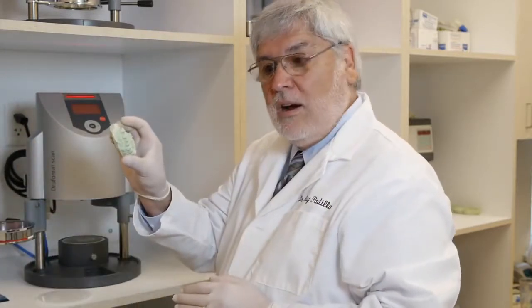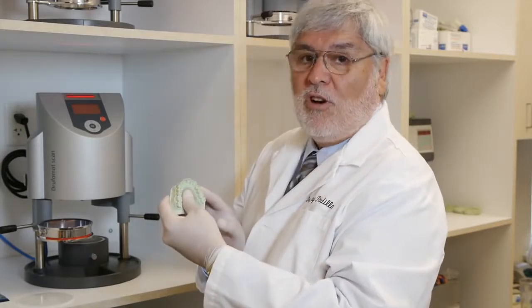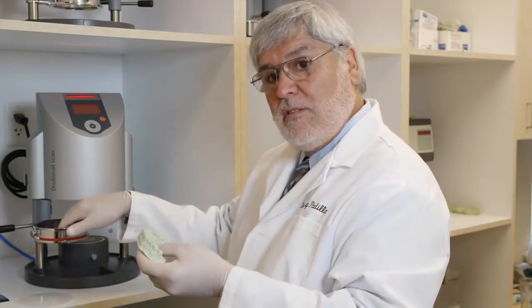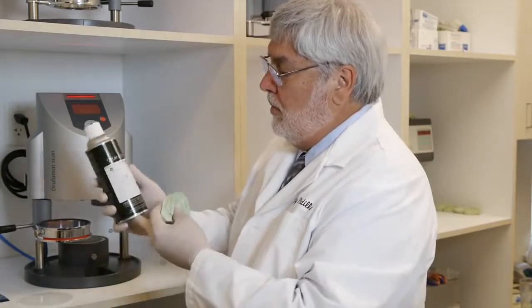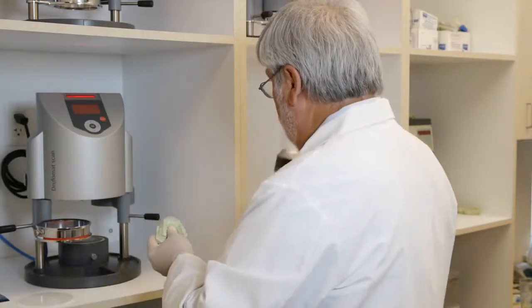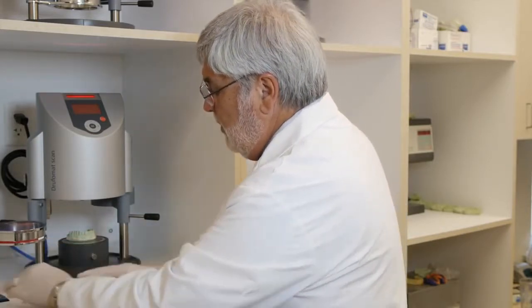We're going to place our mouthguard on the tray. Now this model has already been pre-lubricated with orthodontic model soap for about 30 minutes. This will keep the mouthguard material or any other plastics material from sticking to the model and possibly breaking the teeth. It's extremely important to lubricate these models. If you don't have the orthodontic model soap, you can use Trim Right silicone spray by Dentsply. Again, once it's been lubricated, place your model on the tray.